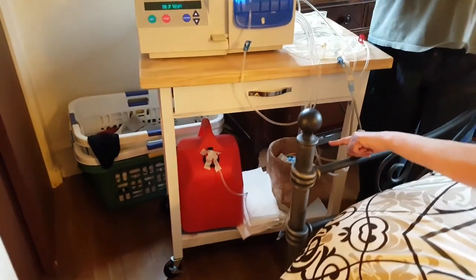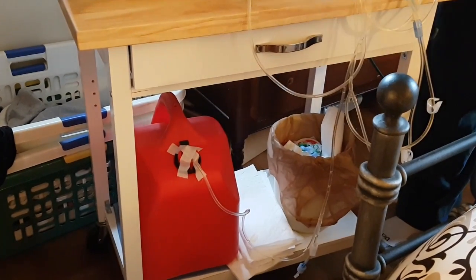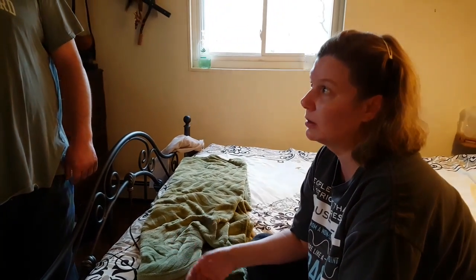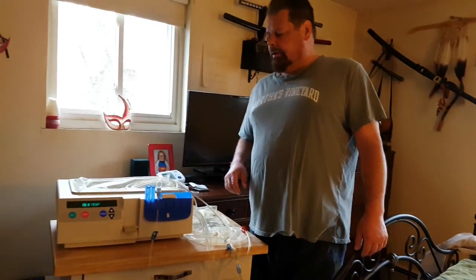Mm-hmm. It's easier to drain. You can use a bag, but we prefer the jug. The jug's easier to empty out in the morning than it would be a bag. And you just pour that down the toilet? Down the toilet. Mm-hmm. Yep.